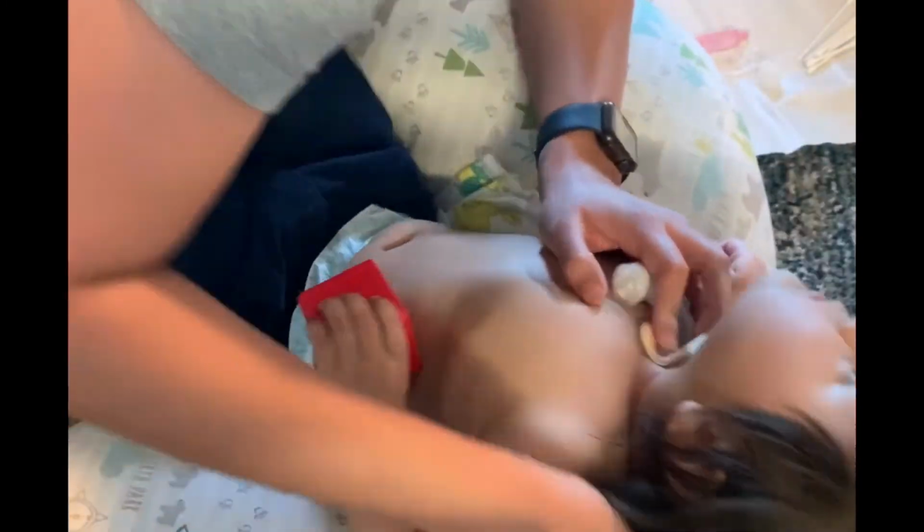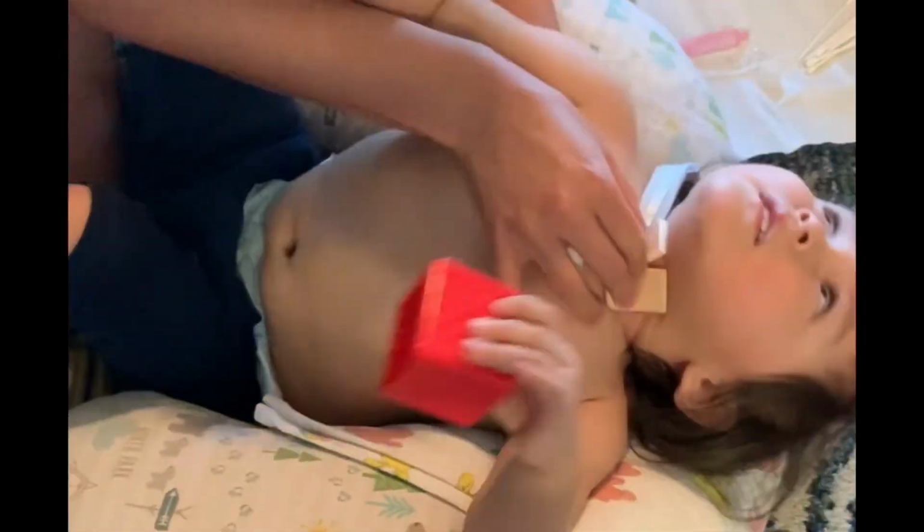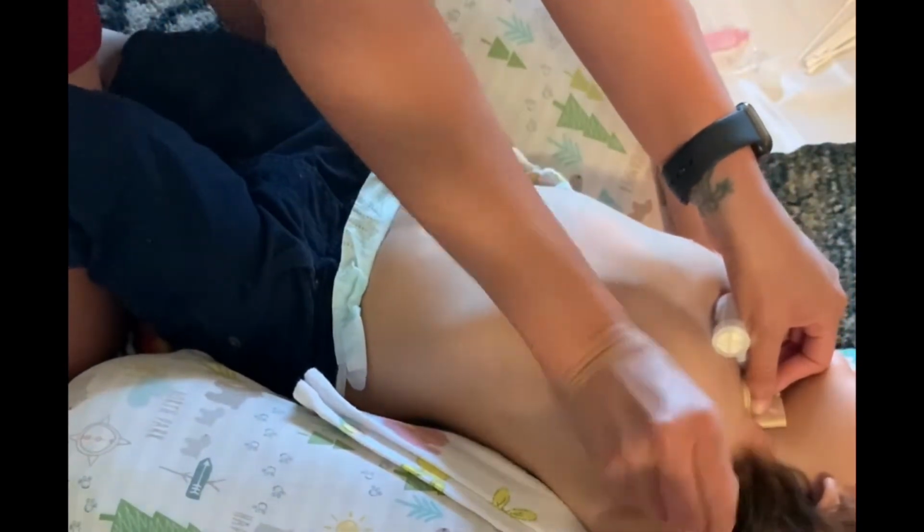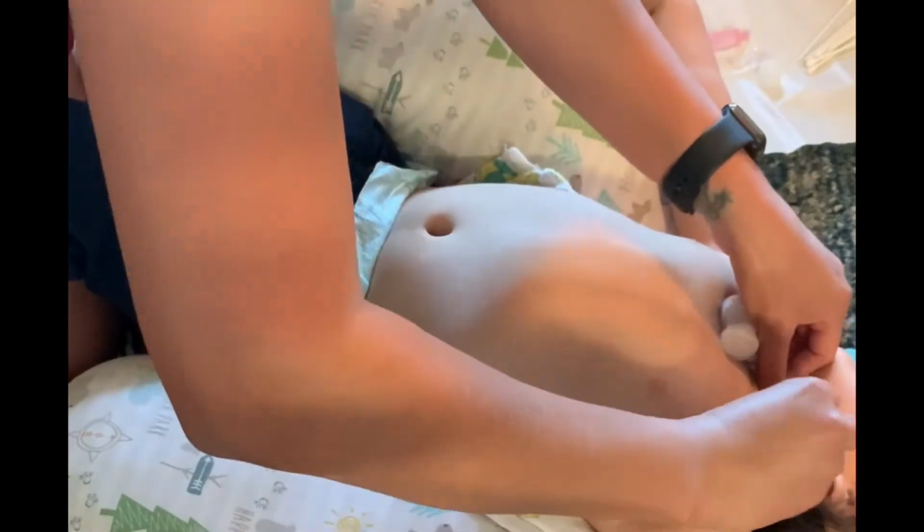It was actually pretty hard for me to do this right now, just because after the trach change, I usually jump over and go on his left side and then quickly do his ties. So that's why he's moving around quite a bit. And that's how we do a trach and tie change.